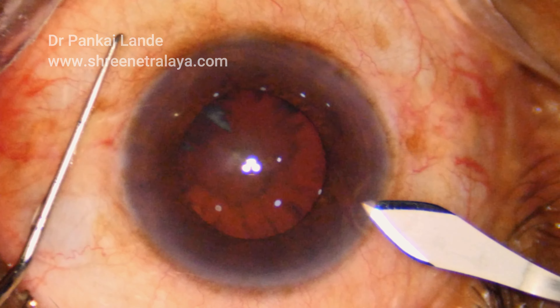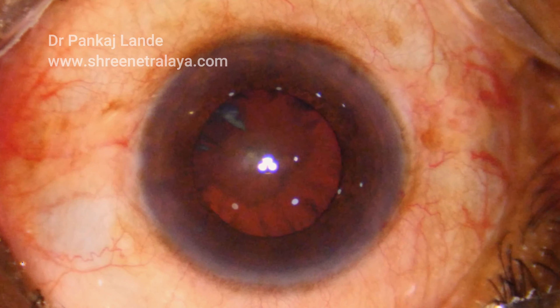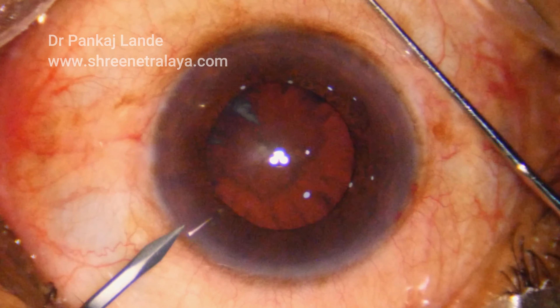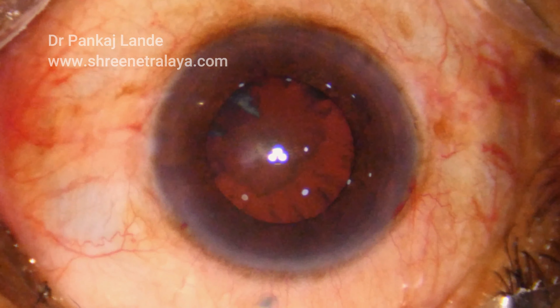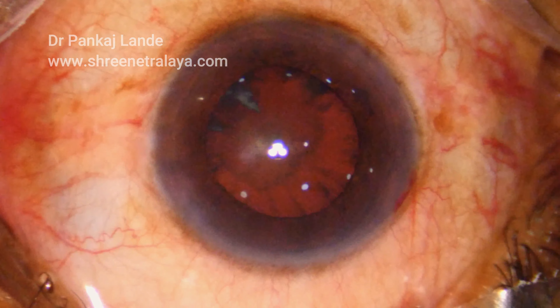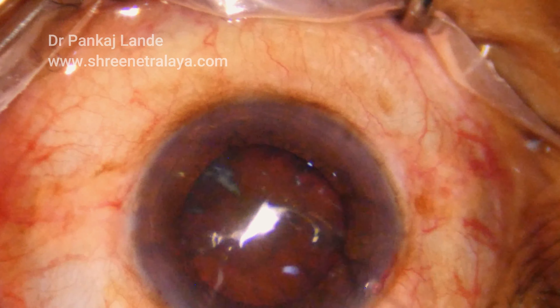Hello friends, welcome to Shrinetra Rai. Today I will be showing you a concept to manage pre-chopping with the help of ultrasonic energy — that is, ultrasonic pre-chopper — which can manage a very hard nuclei very comfortably and cut it like a piece of cake.